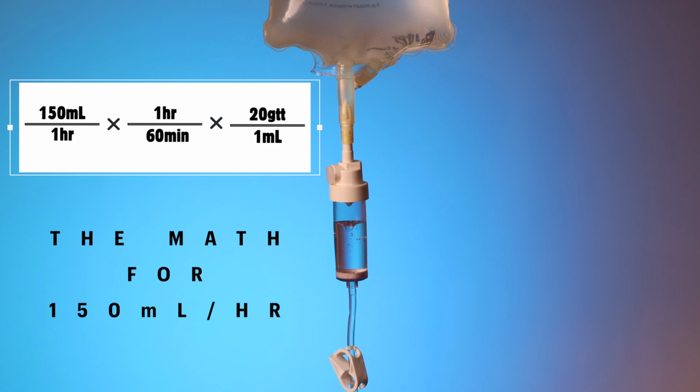This is our final drip rate of 150 mLs per hour. You can see the math on the screen here.